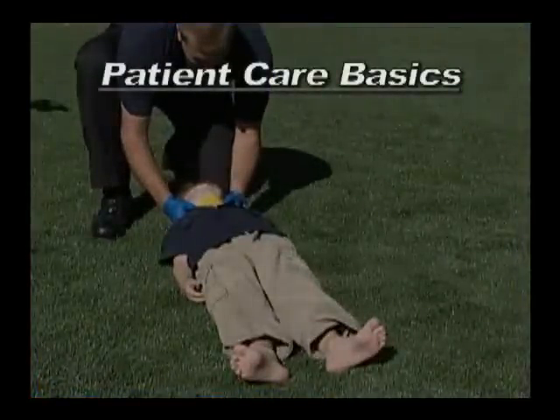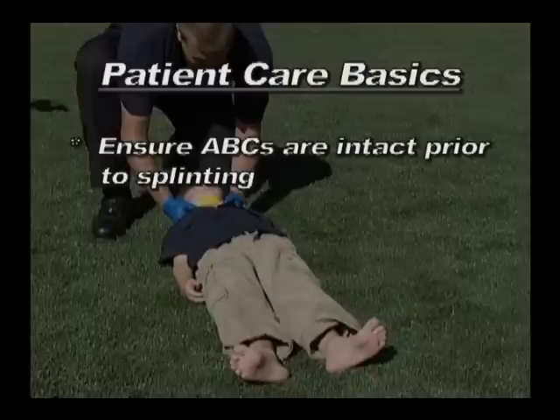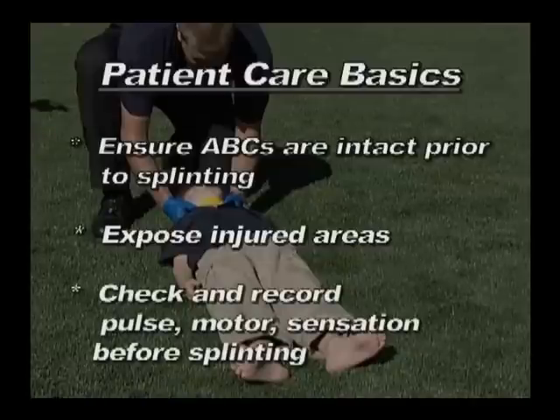Here's a brief overview. Ensure that the basic ABCs of airway, breathing, and circulation are intact prior to any splinting activity. Expose any injured areas and observe skin color and symmetry.